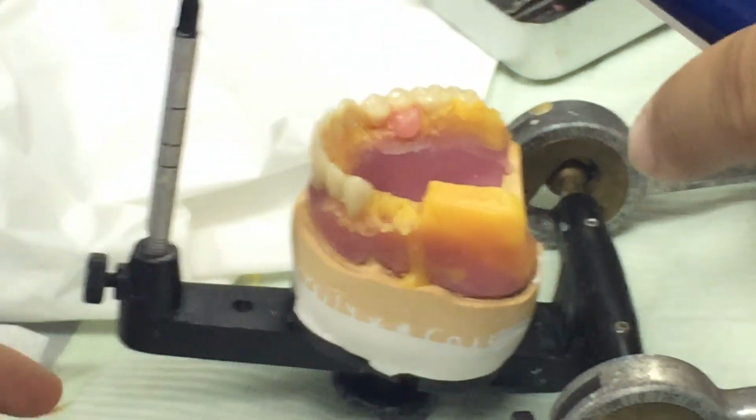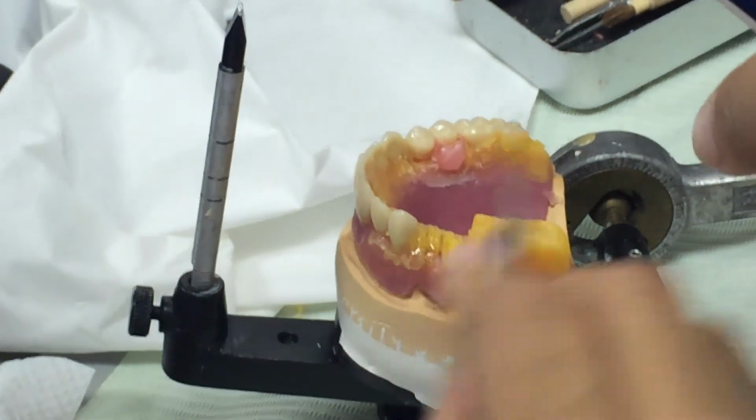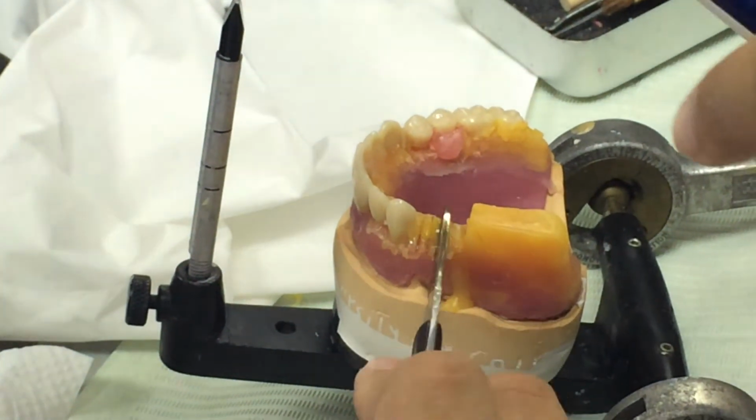Which cusp will touch the occlusal plane? The palatal cusp.